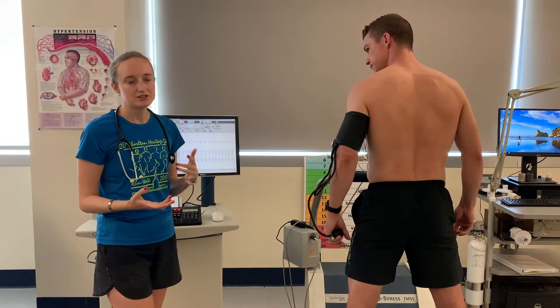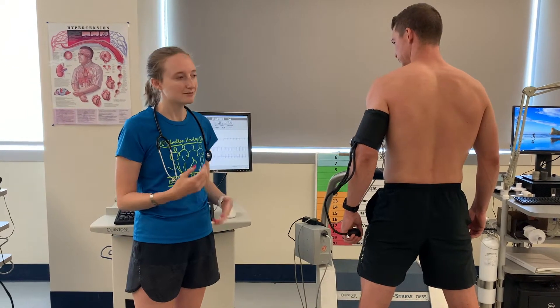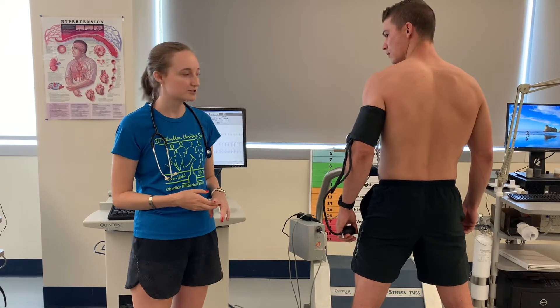So as we're going through the stages of the Bruce protocol, we're just going to be taking blood pressure, heart rate, and RPE at the end of each stage. I usually start at about 45 seconds before the end of the stage, just to make sure I get that blood pressure, and then do heart rate and RPE at the very end.